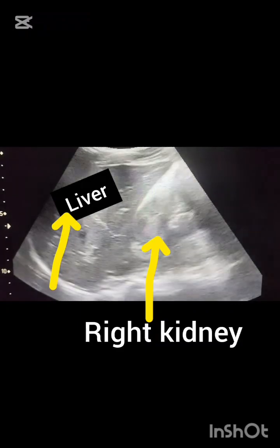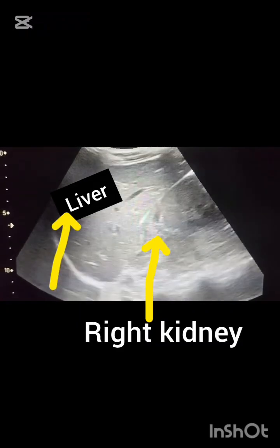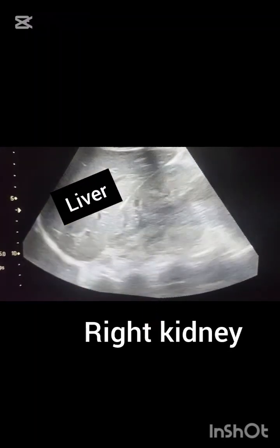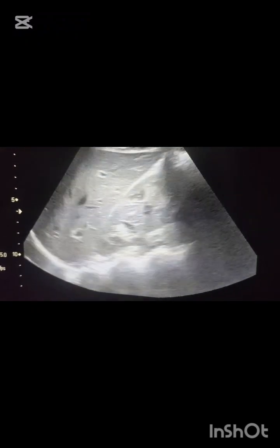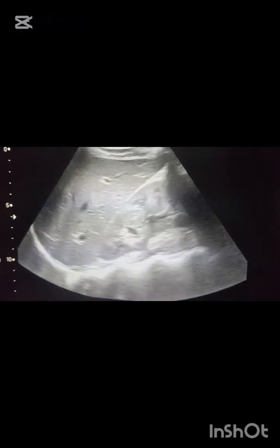So in this video you can see the right kidney. When we compare the texture of the right kidney with the liver, you can see the enhanced echogenicity. So the parenchymal change is seen in this kidney. In earlier videos you have seen the texture of liver and kidney that is normal. So enhanced echogenicity of the right kidney leads to parenchymal change.